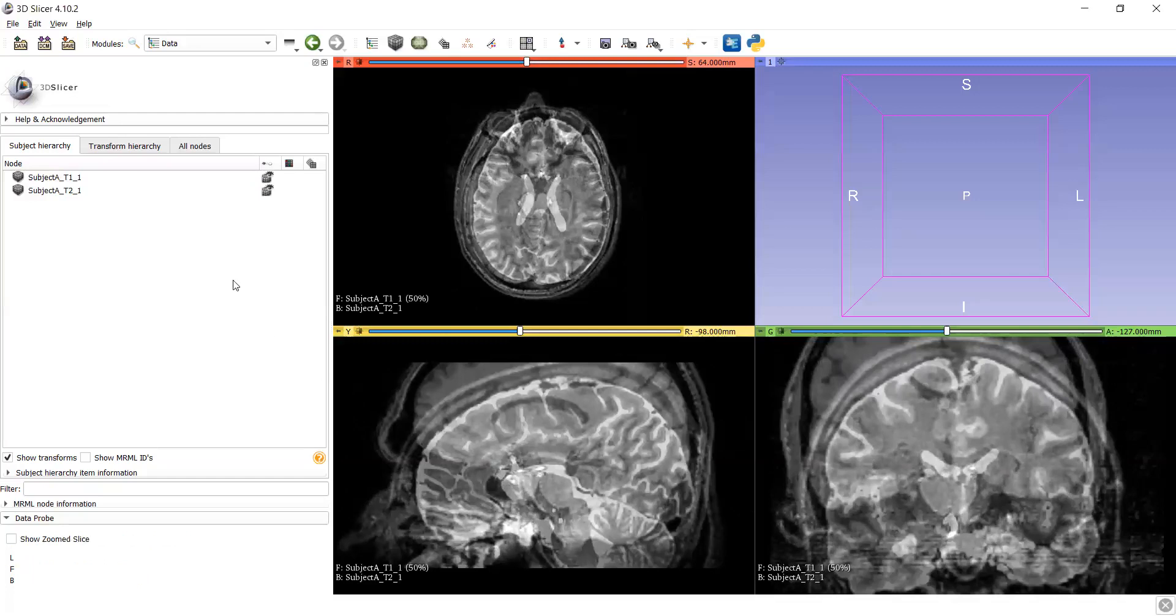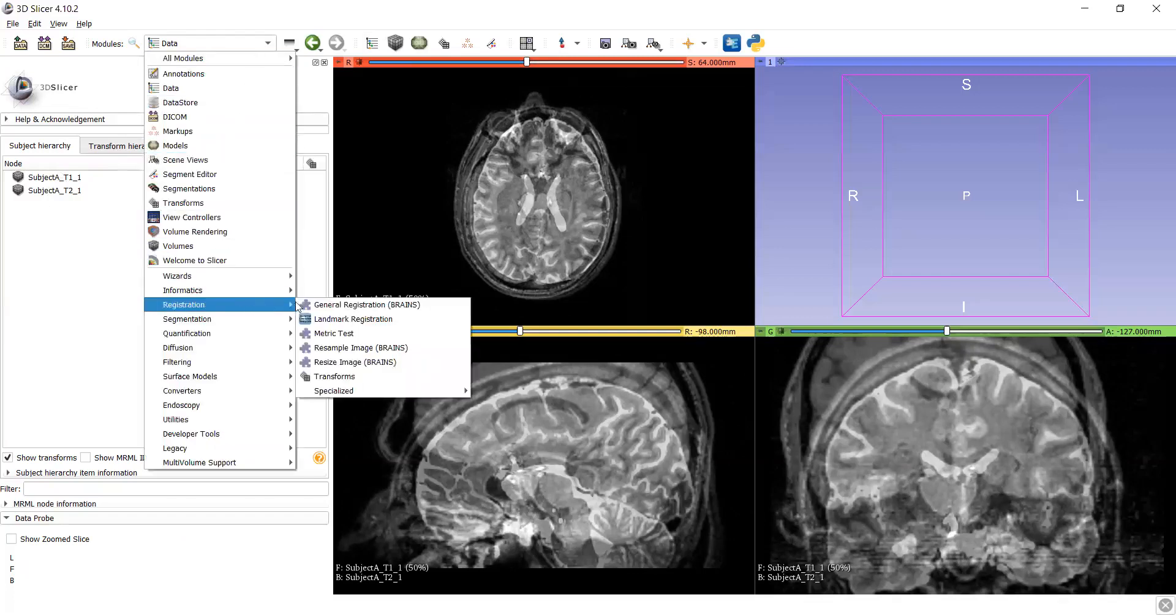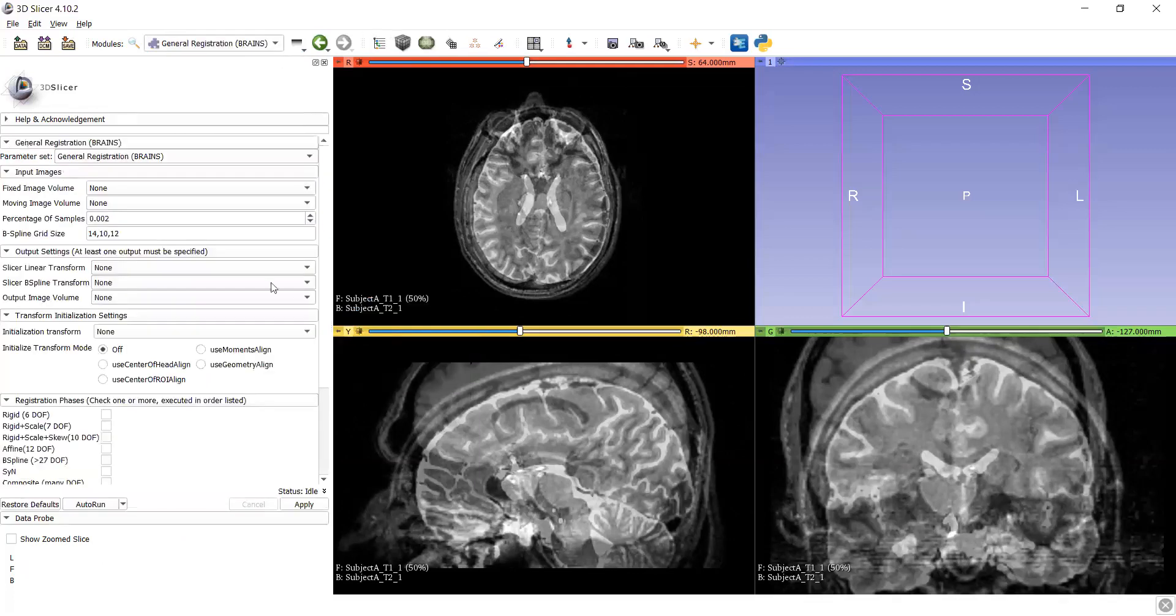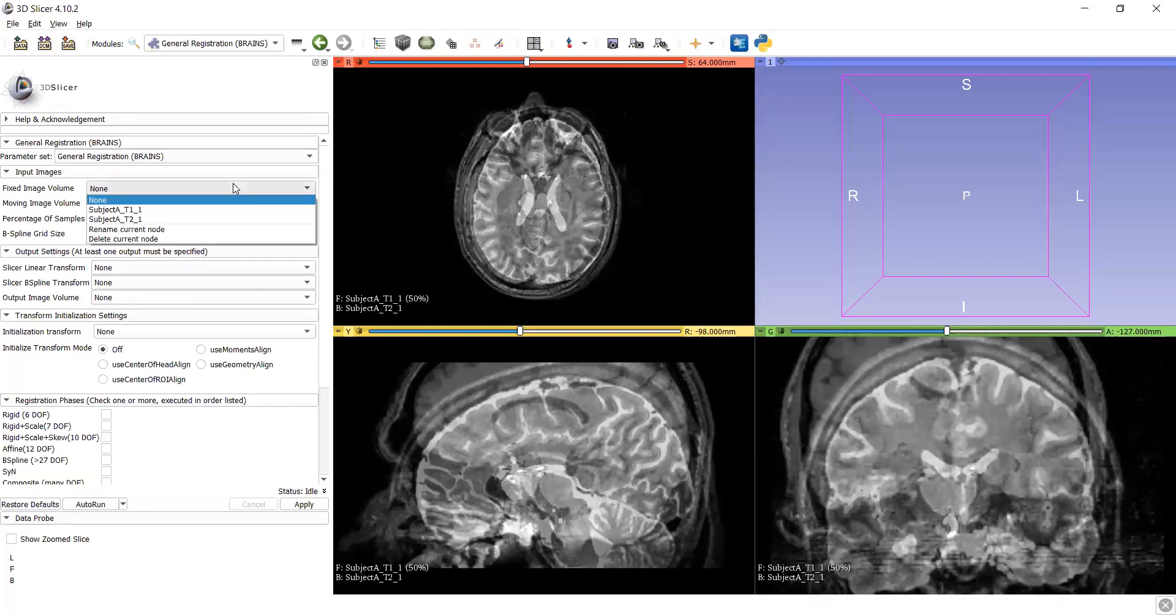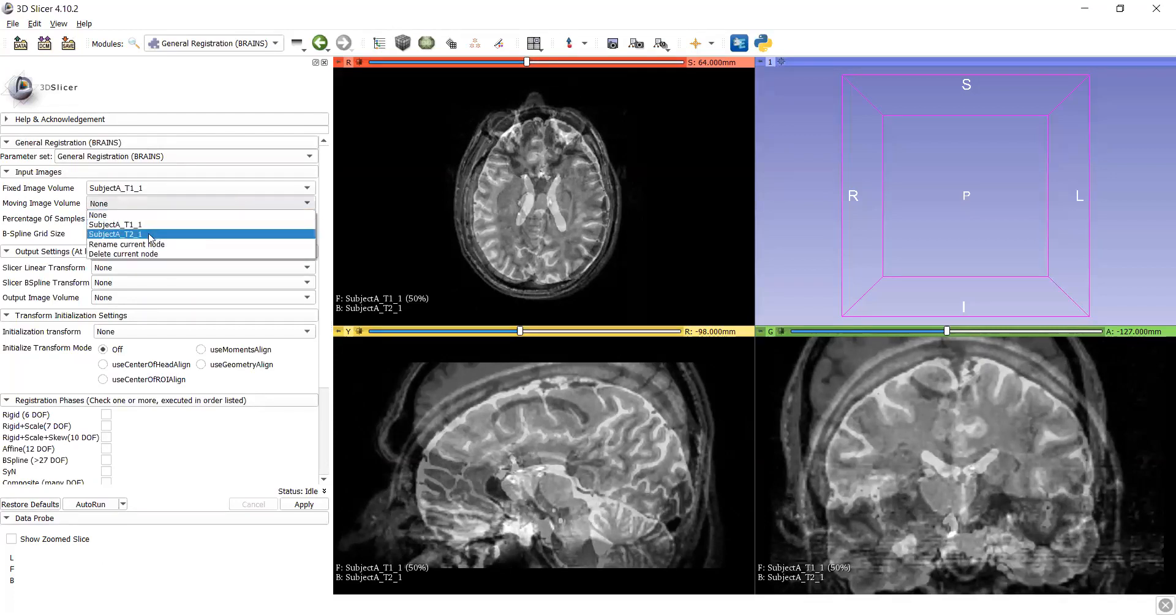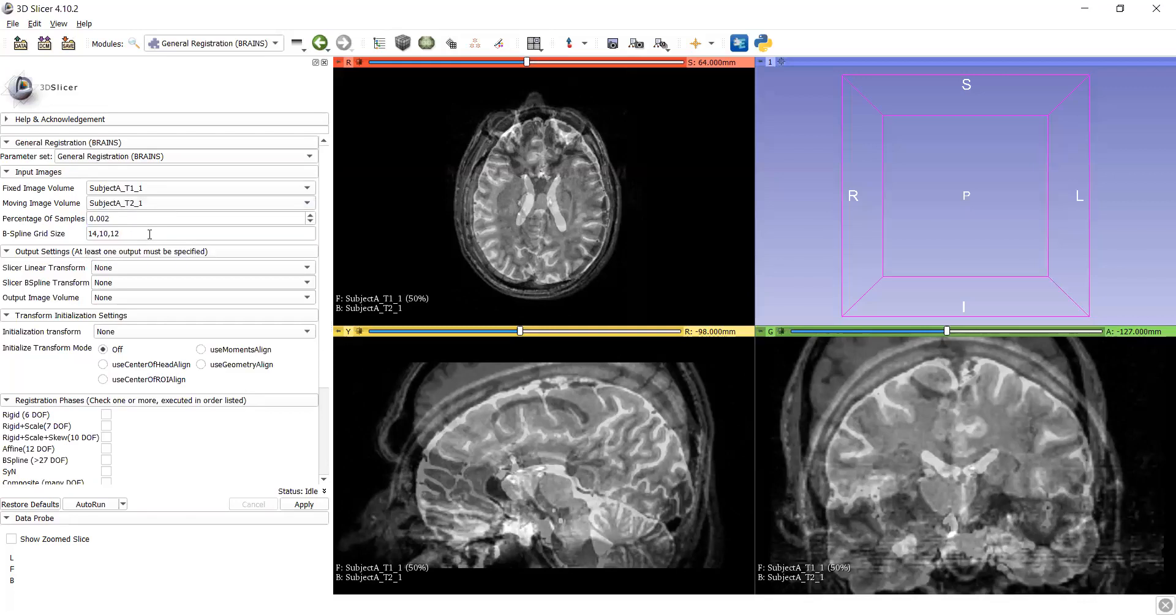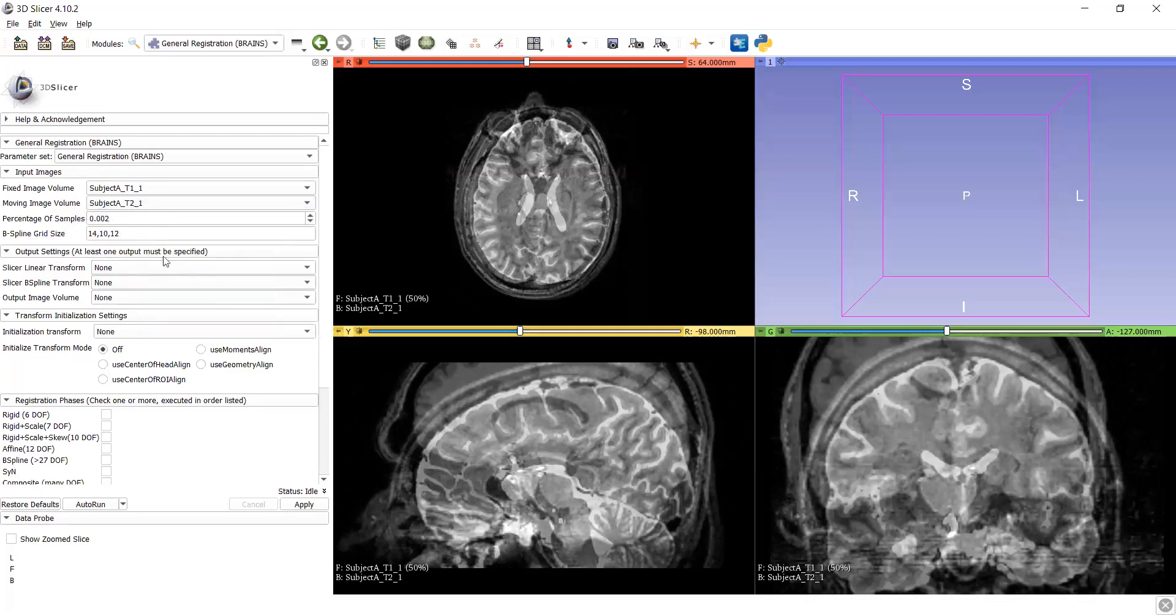For this, firstly go to registration, here general registration. And in general registration, fixed image, let's take fixed image as a subject T1 and moving image, let's T2. And percentage samples.